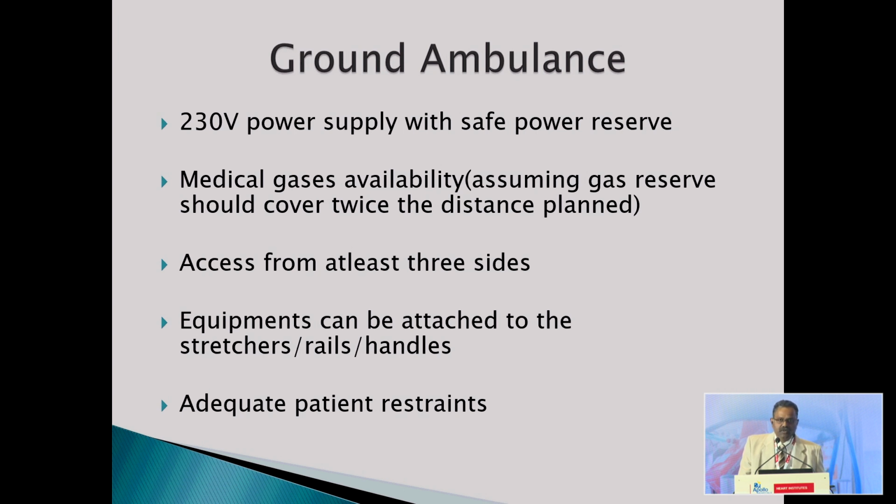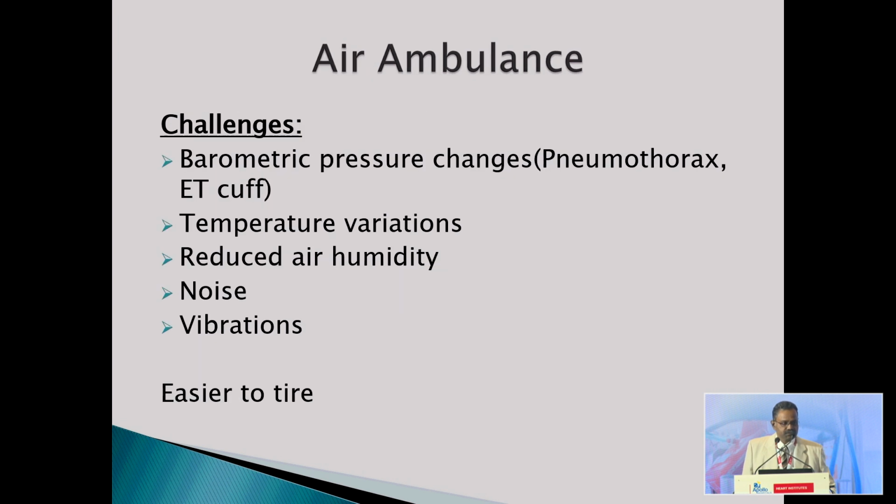So one side will always be close to the ambulance. The other 3 sides, the patient should be accessed in case of emergency. So the stretcher or the railings and other things should be of the dimension so that the equipments can be attached to it, and during the transfer they will not slip out. Also, one should have adequate restraint for the patients so that the patient will not fall during the transfer.